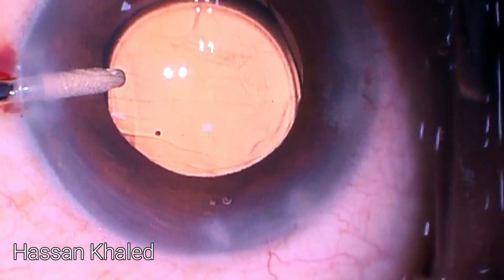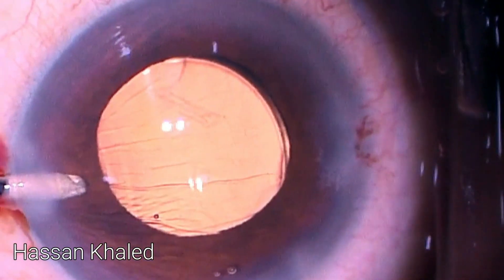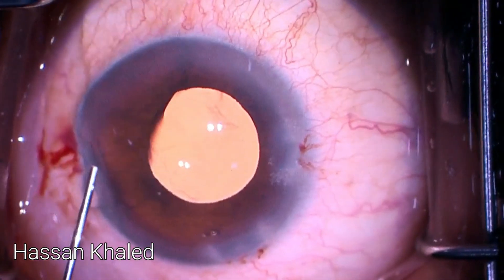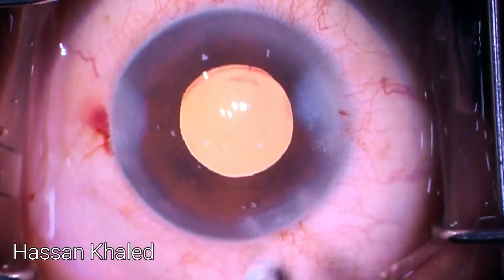I then injected Miochol to constrict the pupil, as you can see, and performed stromal hydration of the paracentesis. However, there was still viscoelastic inside the anterior chamber, so I went back inside.